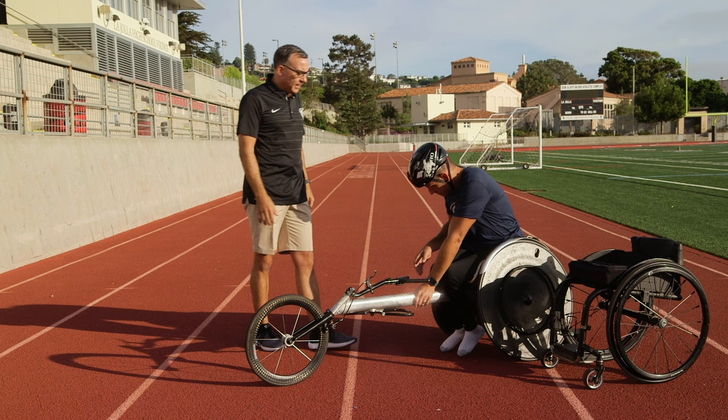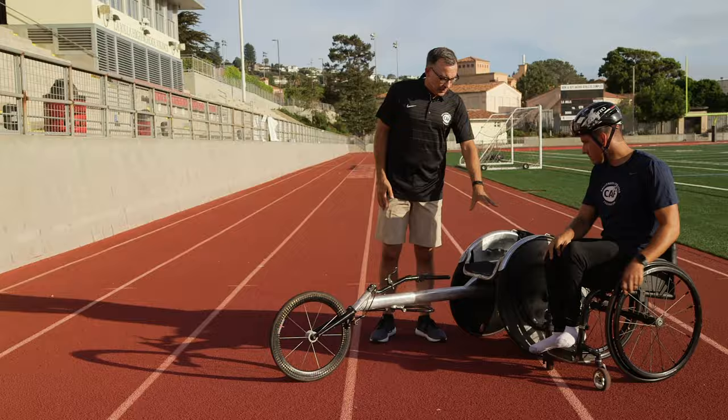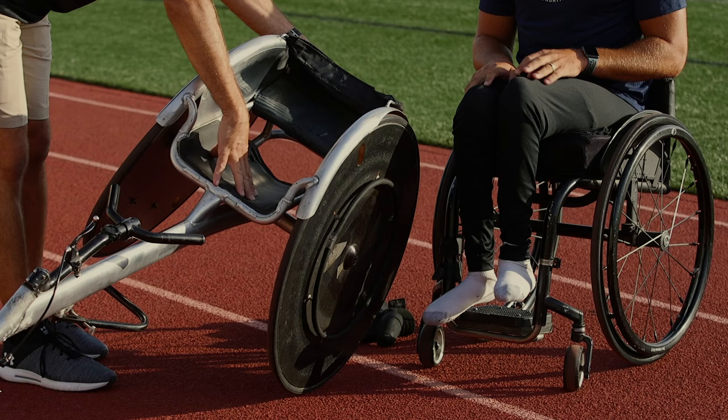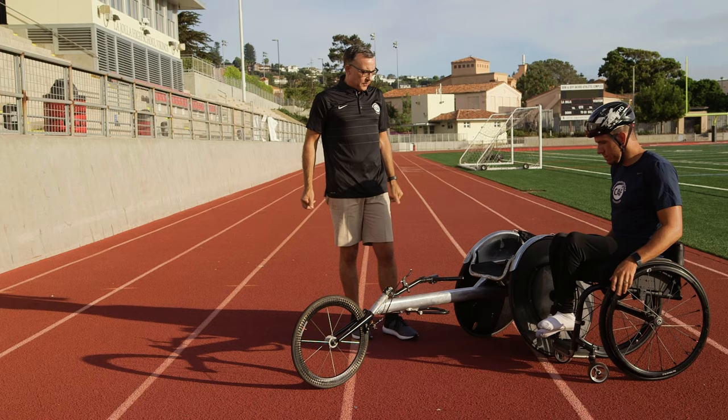Now we're going to see how Eric gets into his chair normally. Eric's chair is what we call a U-cage, which kneelers use. You'll see here on the chair that there's a kneeling pad and a seat. Eric's feet will go right underneath the seat, so he's not sitting on his legs entirely.